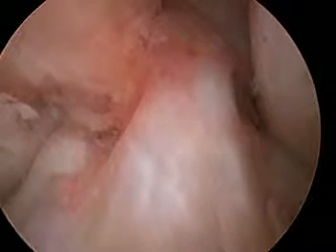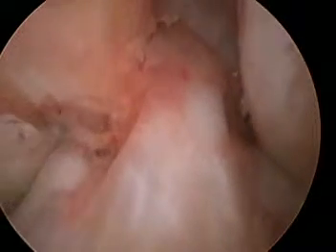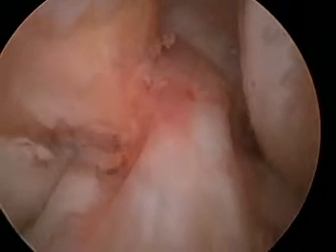So now we're going to map the thigh bone, straighten the leg out all the way, flexing it back. That looks good. We're just going to slip on back behind the knee and look posteriorly and laterally. And there's no loose bodies back here. Rotating the scope centrally and withdrawing. Once again, we see the main stabilizing knee ligaments, the anterior and posterior cruciate ligament, and they look good. The next step is to look at the kneecap from above.